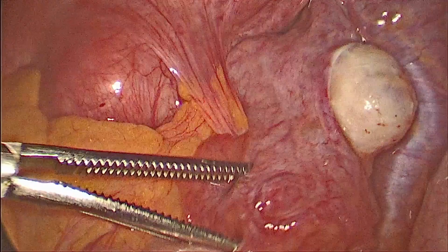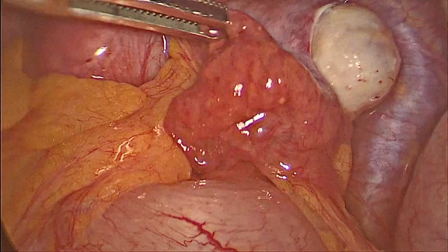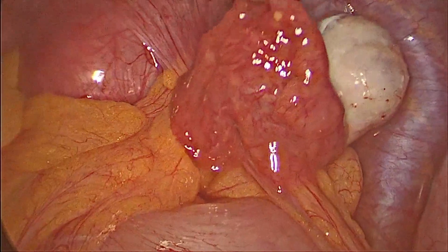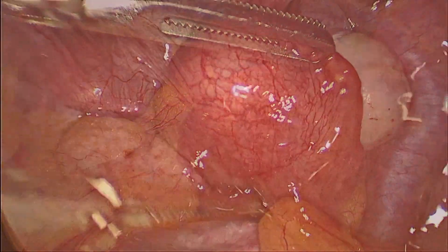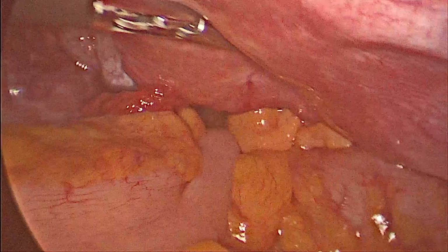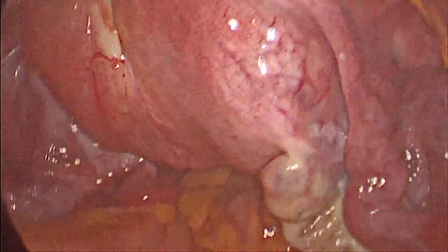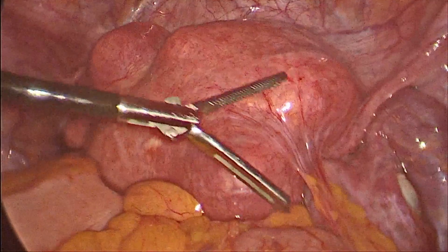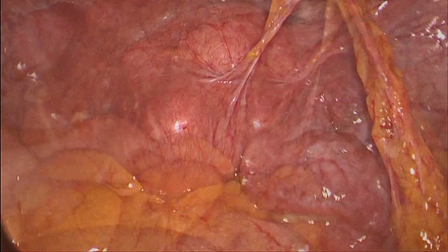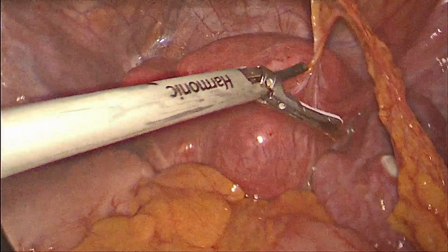Few adhesions are present. Right tubal fimbrial end is also seen normal. There are few adhesions on the fundus of the uterus. We can see multiple fibroids are present both anteriorly and posteriorly.